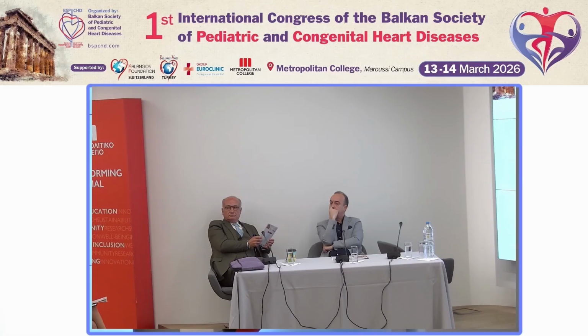I don't think there is any disagreement. This is just what I have said, that we want to pick up the best of each modality. So no doubt that MRI is fantastic, the gold standard for functional measurements. I would rely on MRI regurgitant fraction rather than echo, because regurgitant fraction is much more objective. So important is picking up the best from each modality. Definitely, definitely.